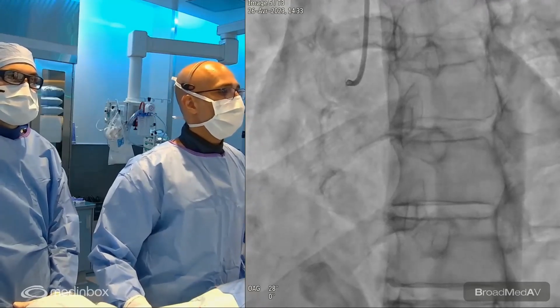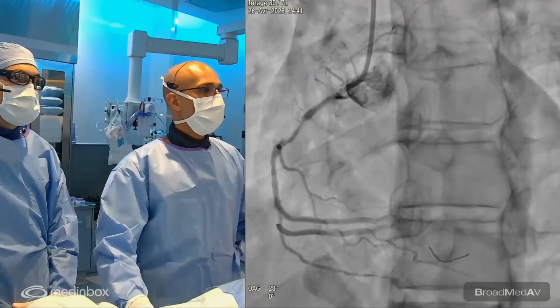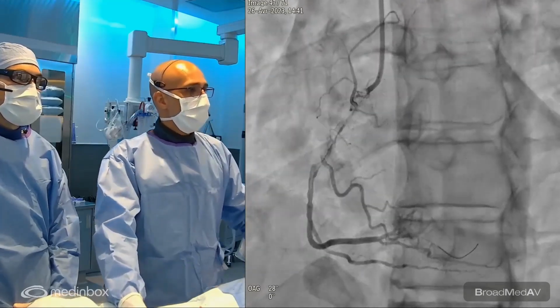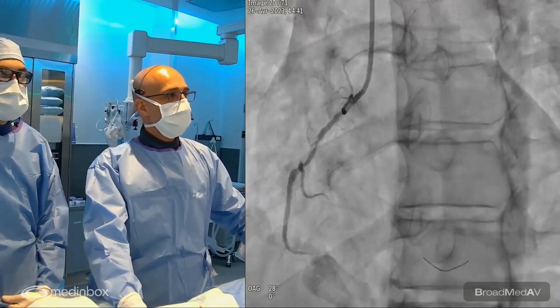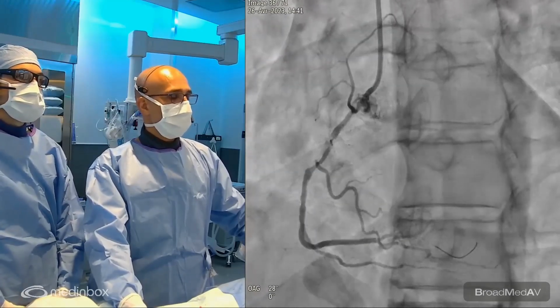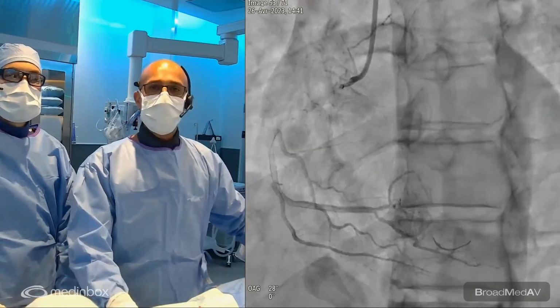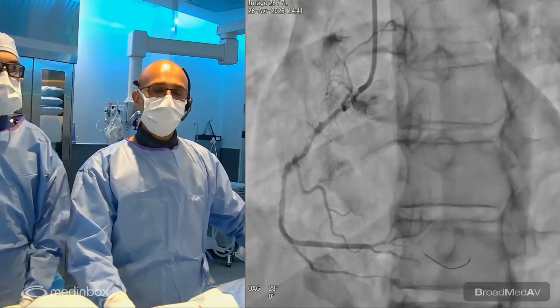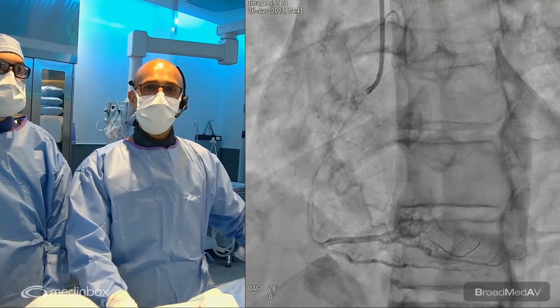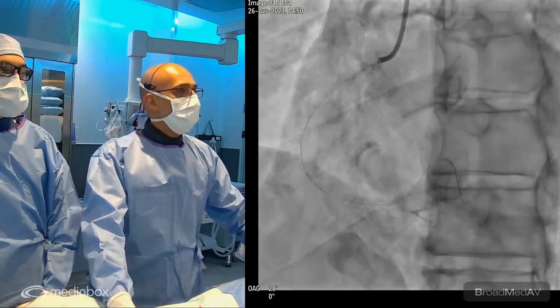So we crossed the distal lumen with a workhorse wire that we then swapped for the Viper wire. My choice for orbital atherectomy here was mainly because I thought that with this kind of CAD, we are very likely to be dealing with deep calcium. And in the context of deep calcium, you need a therapy type that will affect the deeper tissue. And if you take rotational atherectomy, for example, you will just affect the superficial tissue, the superficial calcium, and then you might not get good expansion following that. And as you'll see in the coming case. So next image.